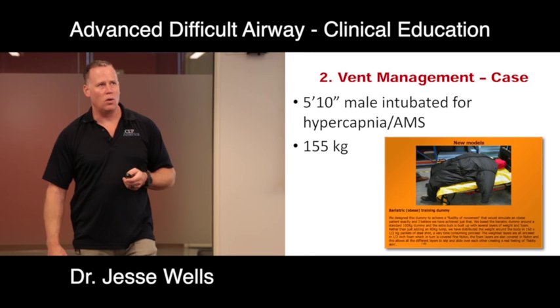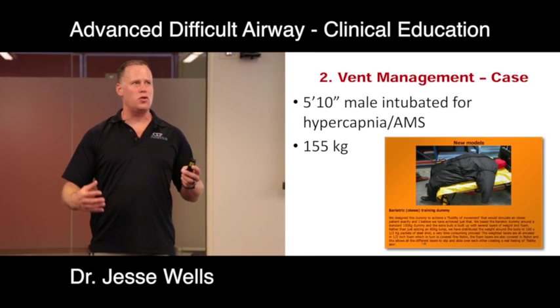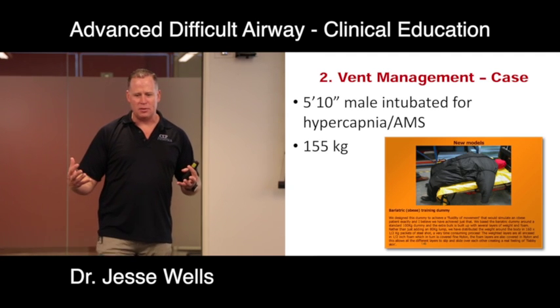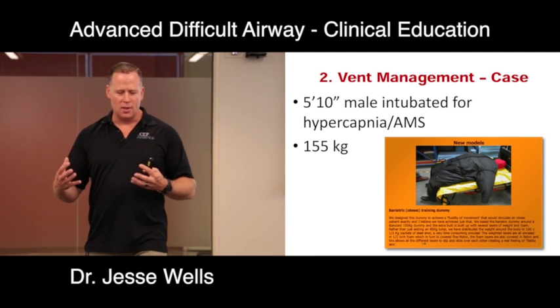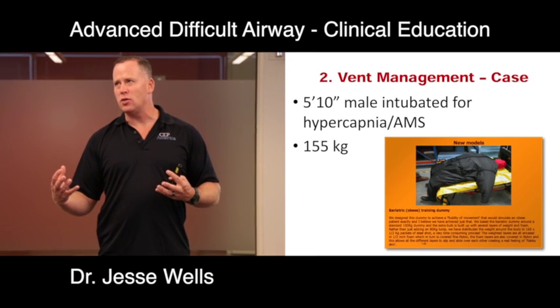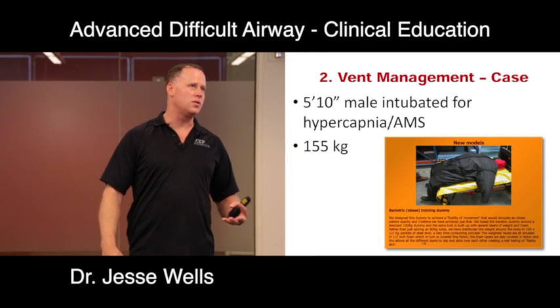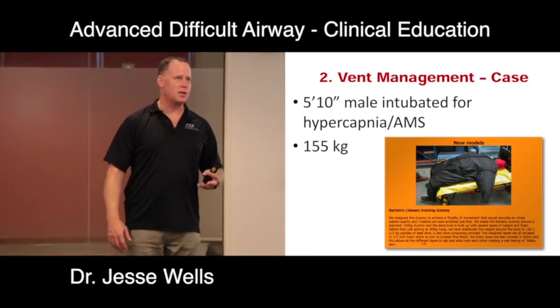All right, so this picture is of this new concept. It's a bariatric training dummy, and what they did is they took lead powder and sewed it into this suit in the arms and legs, and basically this is a training dummy for EMS to use to simulate our bariatric patient population.